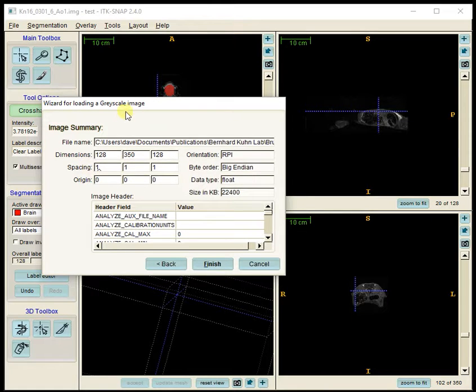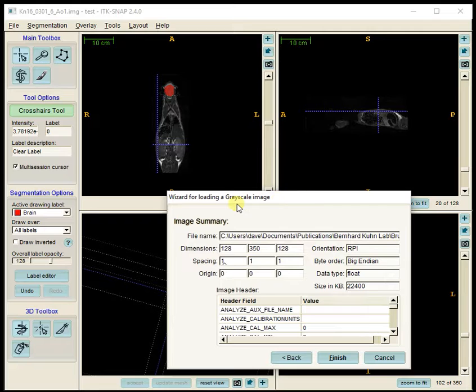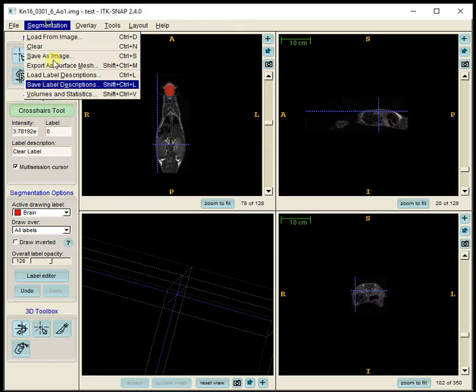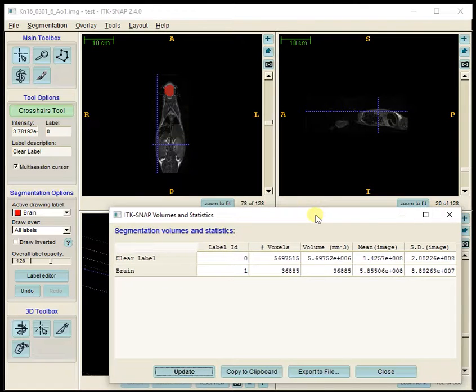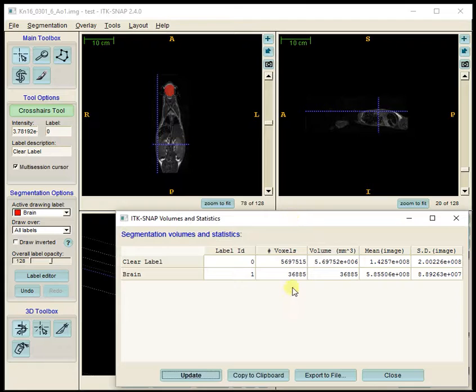So now you can see the spacing here is 1 by 1 by 1. Unfortunately, for raw data files, you can change this, but I haven't been able to find a way to change these numbers. So for an analyze format, I believe you are stuck with 1 by 1 by 1 millimeter. Now that may not be accurate. It may be the way that I saved or first created the analyze file.